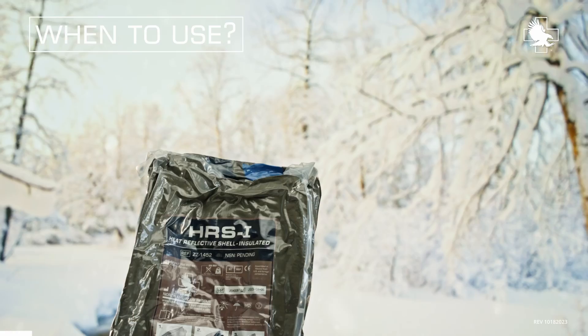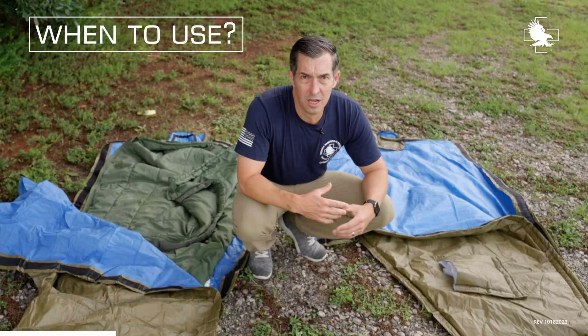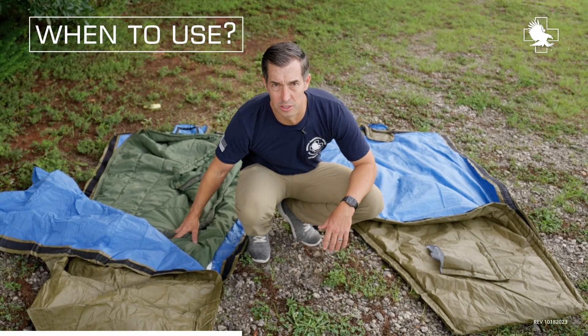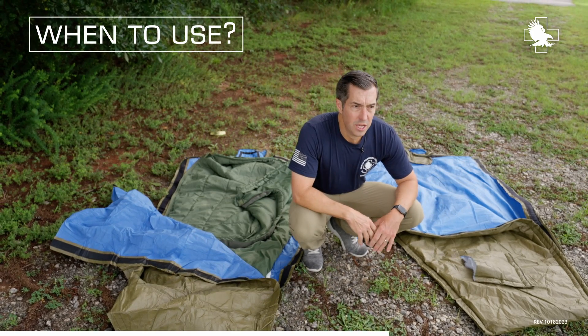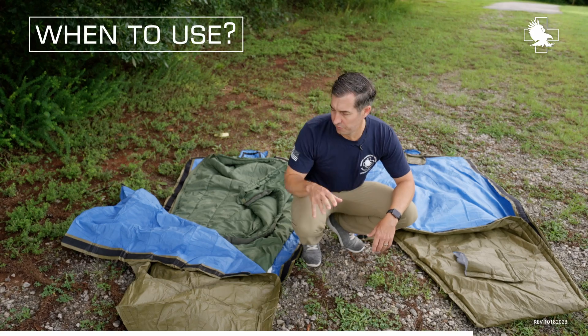When would you want to use the HPMKi? Really, anytime you're concerned about hypothermia and you want to have it all in one single package — it's ready to go. You don't have to mess with an extra sleeping bag, and no one's losing that. This one stays with the casualty. So you may want to consider switching over to the HPMKi for colder environments, which we're coming up on in the fall, so you can put it all in one package.